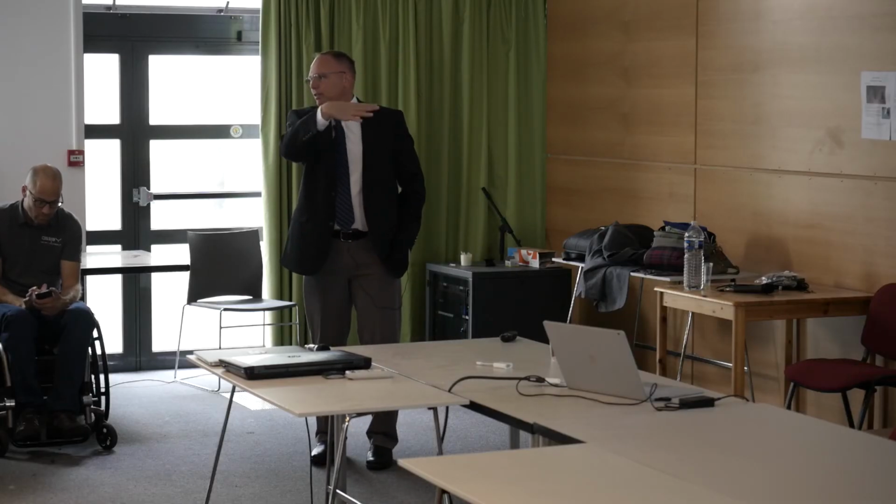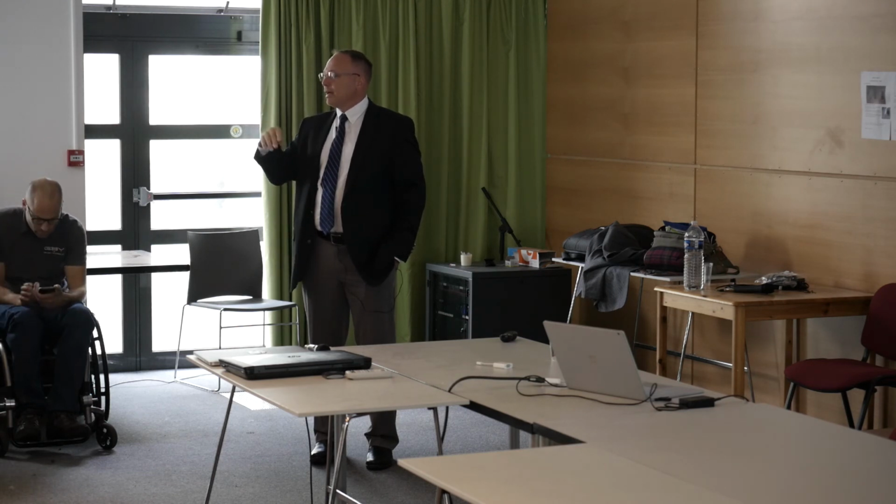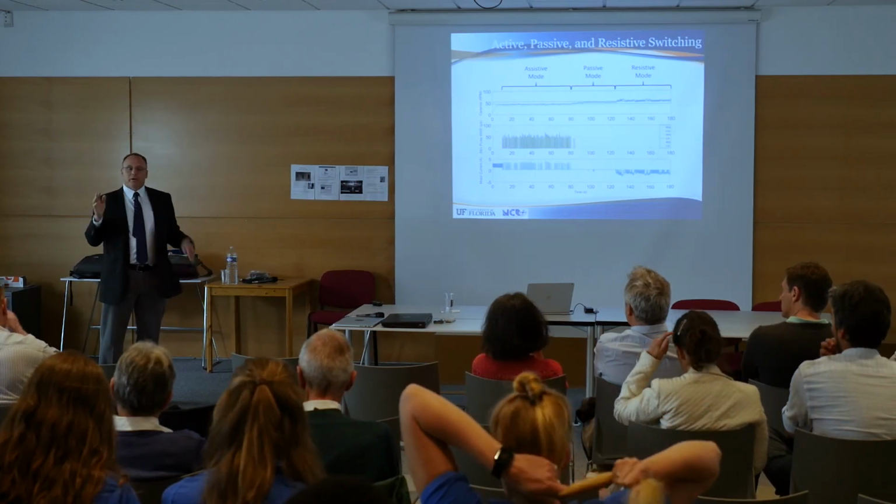Even before the work that I presented here, we did exactly those kinds of things. We even did some random things where we would randomize the frequency. We would be stimulating them at a certain frequency while they were exercising, and we would monitor fatigue, and see, okay, their performance is starting to decline. Now just change the frequency to another frequency spectrum. And in doing so, we were able to prolong.